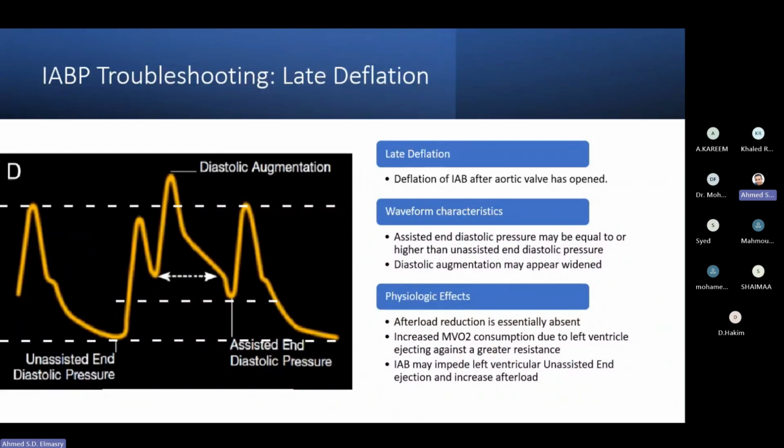In the opposite direction, the intra-aortic balloon will work as a force against the heart during the systole. Actually, what is happening here is that you are increasing the afterload by continuing inflation of the intra-aortic balloon during the systolic cycle. This will increase the workload of the heart and the oxygen demand of the heart in order to overcome the greater resistance from the balloon inflation.